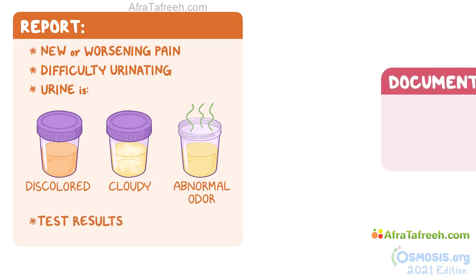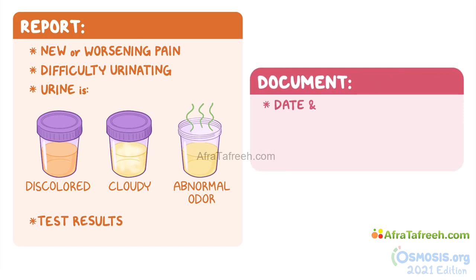When you assist with urine testing, document the date and time, the test results, and any observations regarding the quality and quantity of urine.